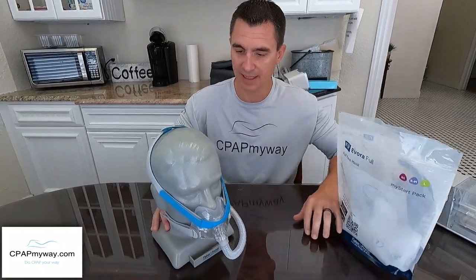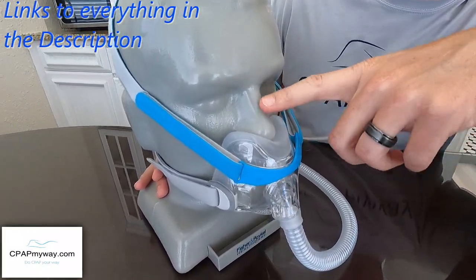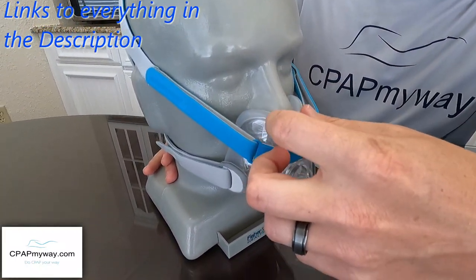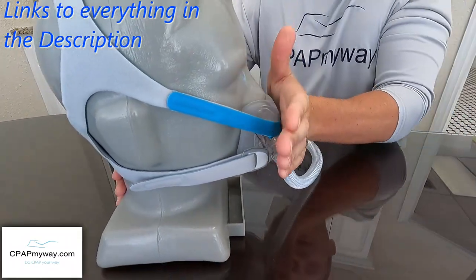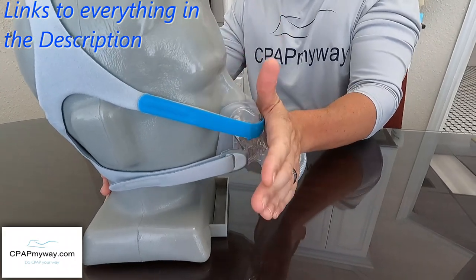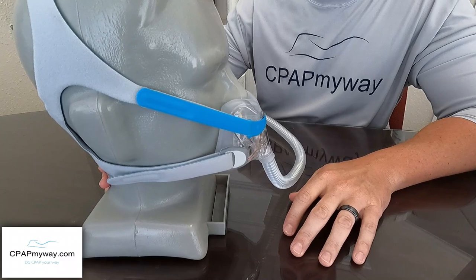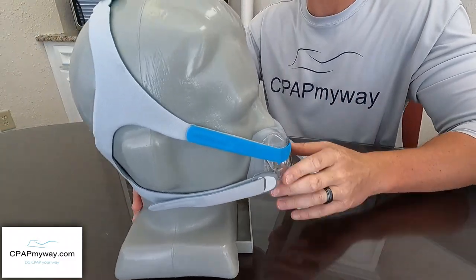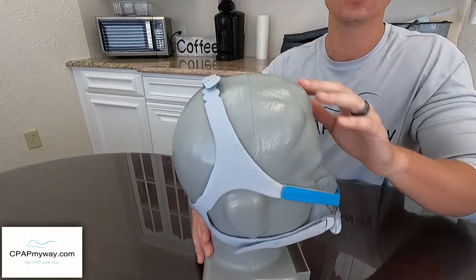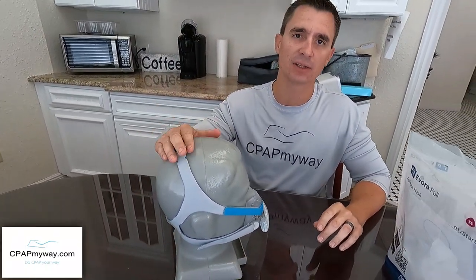A couple of things about it while it's on the head. Minimal contact is what I term it, but basically it doesn't touch the bridge of the nose — it rests underneath the nose. And as I take it off, you'll see how you're able to breathe through your nose. Profile-wise, it's nice and flat. Reminds me a lot of the Amara View, which I like so much — there's nothing sticking off the front. And it also doesn't have the tubing up top of the head, like the Dreamwear Full or the F30i, which have the hookup on top.